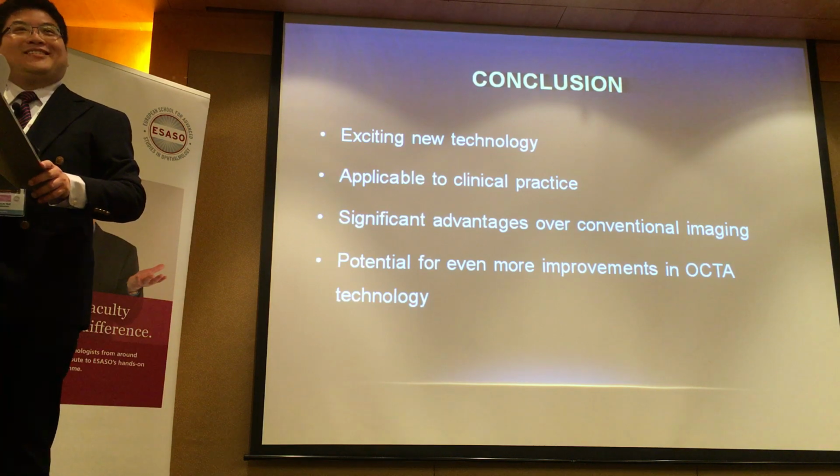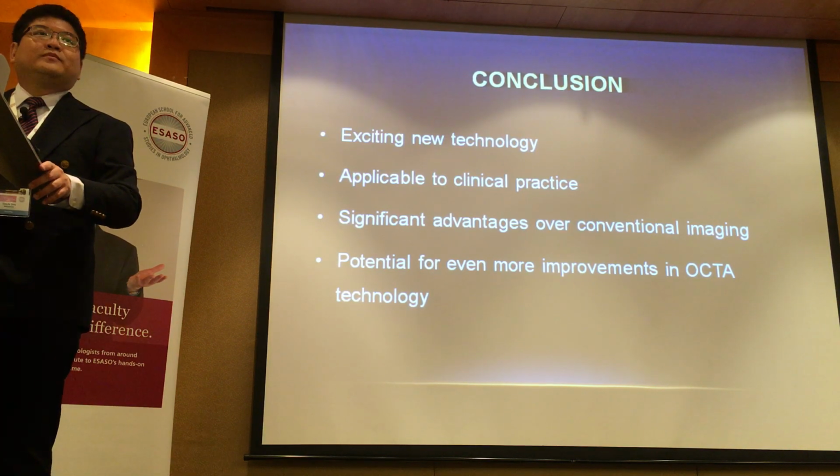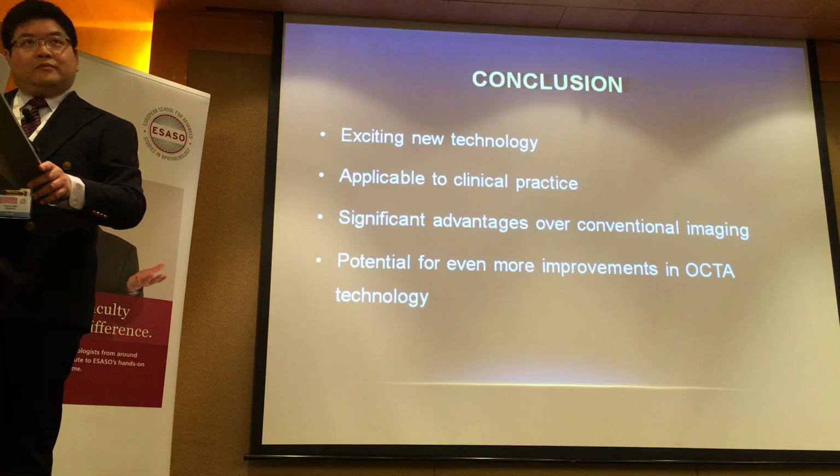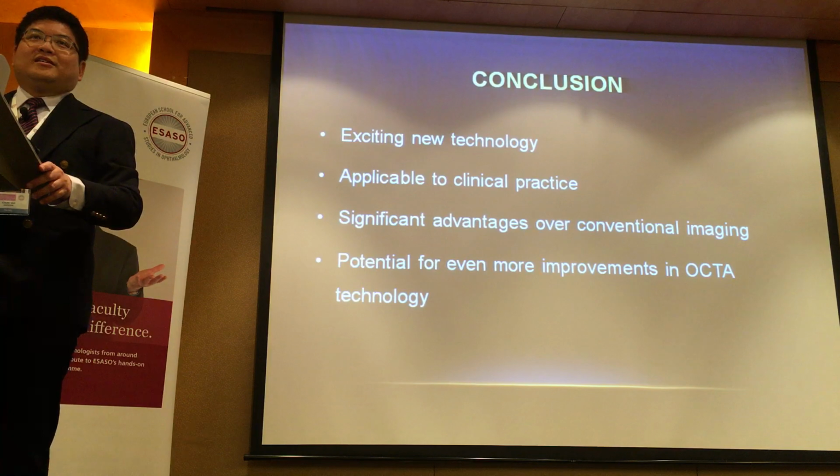I'm from India. Very nice presentation. I would like, if you have some pictures where you differentiate the active and the inactive, it would be a great help if you could show us some pictures. On the OCTA, you enlisted some features which suggested activity. But what about those which do not need treatment, or are inactive?